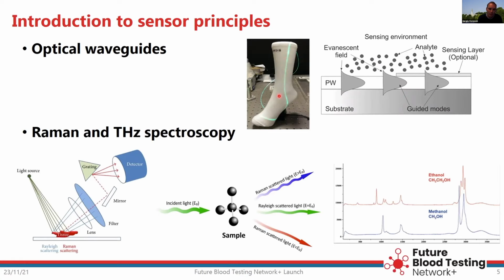And we're working now on some chemical sensors as well. And this is mainly for measuring diabetic foot ulcers. So you can incorporate sensors inside the socks or wound dressing and measure certain parameters. The principle behind this is that you have a waveguide, typically just thin glass. You launch light into it, and then the propagation of the light inside the glass will change with a change of analyte concentration adsorbed or interacted with the optical fiber.